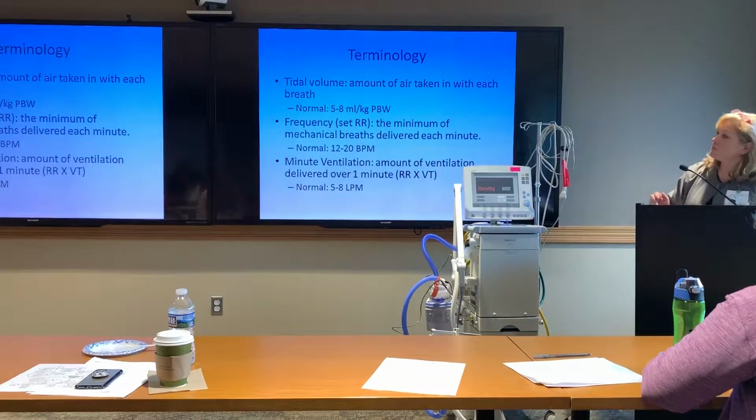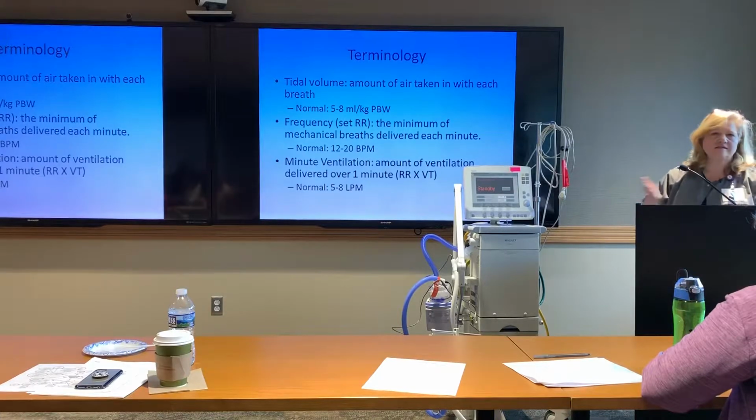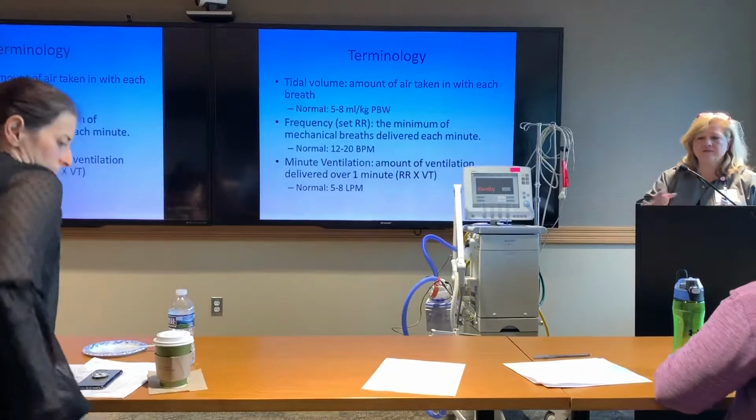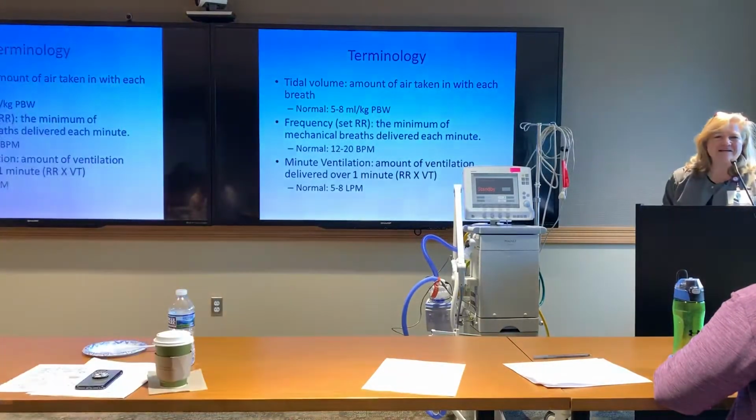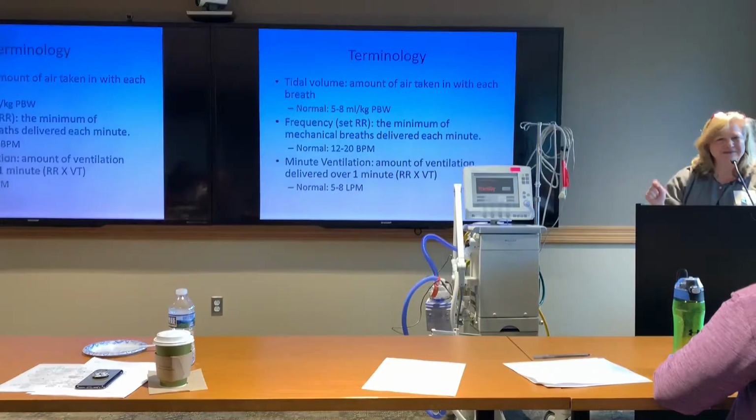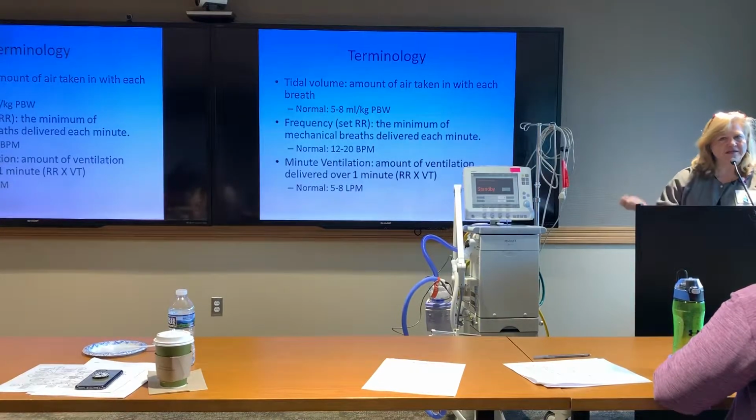All right. Anyway, minute ventilation is just like cardiac output, only it's for the lungs. It's how much you breathe, so the volume you're breathing each breath times the rate that you're doing that, right? Just like cardiac output, 5 to 8 is normal. 5 to 8 is normal for minute ventilation as well. When you guys are sending a blood gas off and you're filling out the blood gas slip, please be sure to note the minute ventilation.